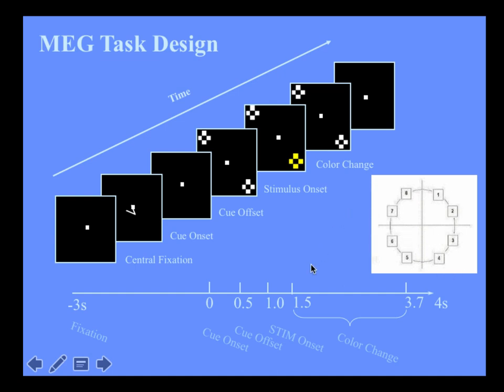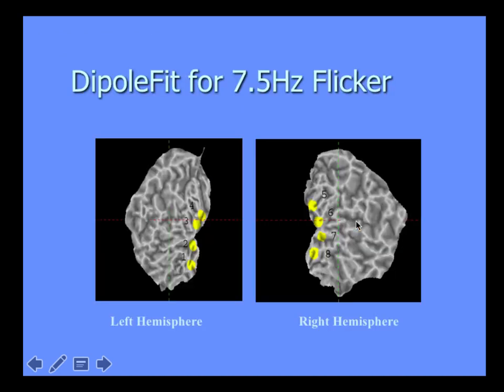The fact that we flicker it at about 7 hertz gives us a tremendously valuable signal rate. So we just extract the 7.5 hertz signal from the MEG, and that's got to be due to this flickering checkerboard. That's how we get really high signal-noise ratio. We've given up our time resolution because this is across all of the signals, but we know where we've done the stimulation, and now we do a dipole fit to that particular signal.